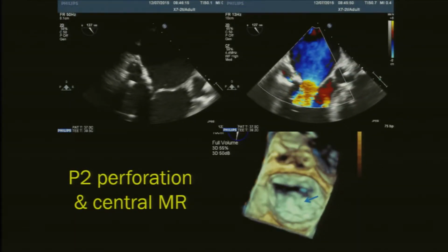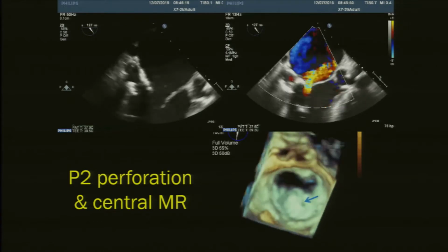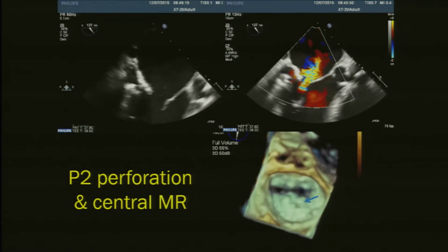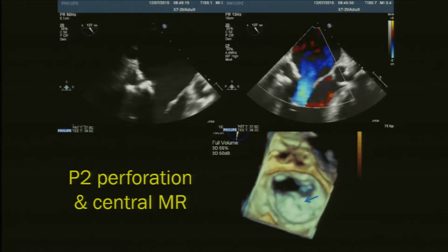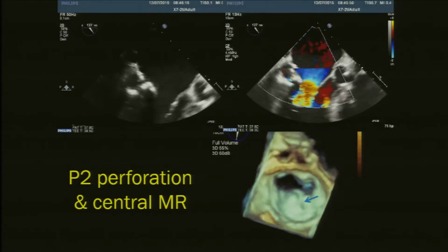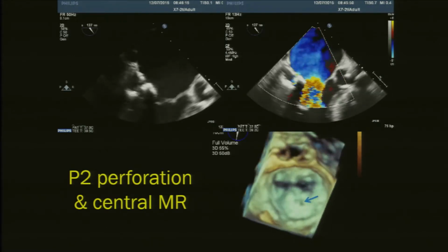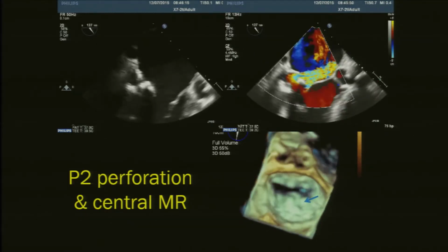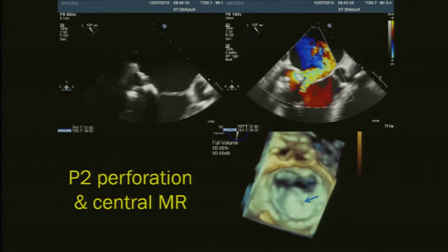And another unique case here that we treated a few years ago was a guy who had bypass surgery about 6 months ago, but then suffered in an LTAC. His EF dropped. He was on chronic milrinone therapy. He had developed acute on chronic renal failure, and was on dialysis, and really hadn't been out of bed in 6 months, and had a perforated leaflet in his posterior mitral valve, as well as some central mitral regurgitation. And here in this 3D view, you're looking down the barrel of the mitral valve. You can see this hole right here where the little arrow sign is, and also a lack of coaptation during systole. So you have two mechanisms for a leaky valve.